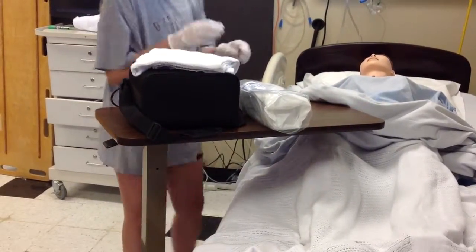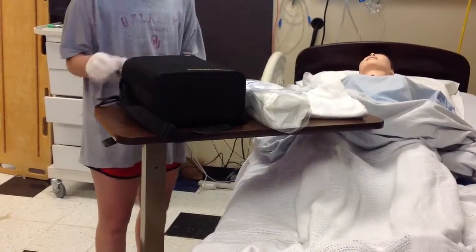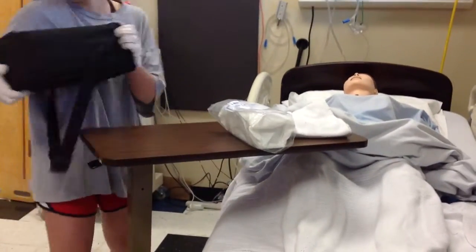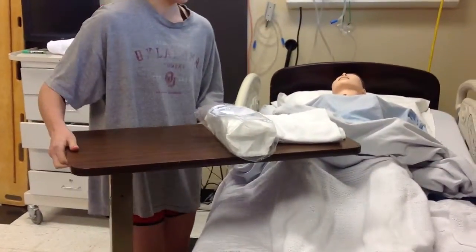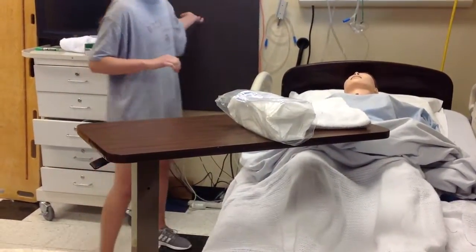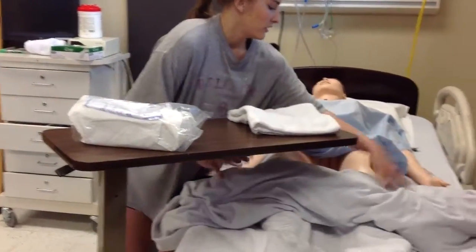Next we're just going to perform the straight cath, and it will get that urine out — the sterile urine — so we can send it off to the lab. I'll take my clean gloves off and take the trash can. I'm going to do hand hygiene.